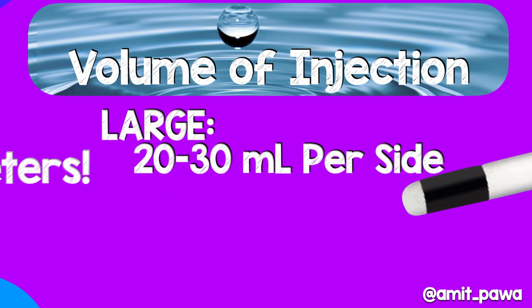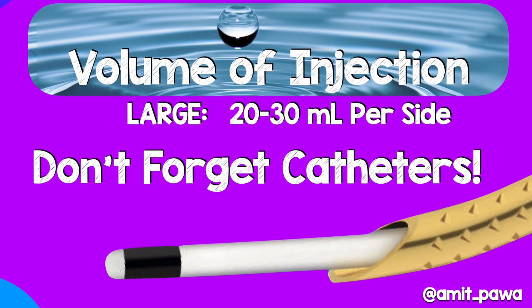side. Of course, we can't forget nerve catheters here, and this plane block is a really great way for you to place a nerve catheter so you can have continuous regional anesthesia. We tend to think now that if you're going to site a catheter in these places, in the same way that you initiate a block with a large volume, these catheters work well with intermittent boluses where you use about 10 to 20 mils as a minimum with each subsequent catheter administration. If you just use something like 8 to 10 mils an hour, it may be that as the initial bolus effect wears off, you may not be able to sustain the quality of analgesia.